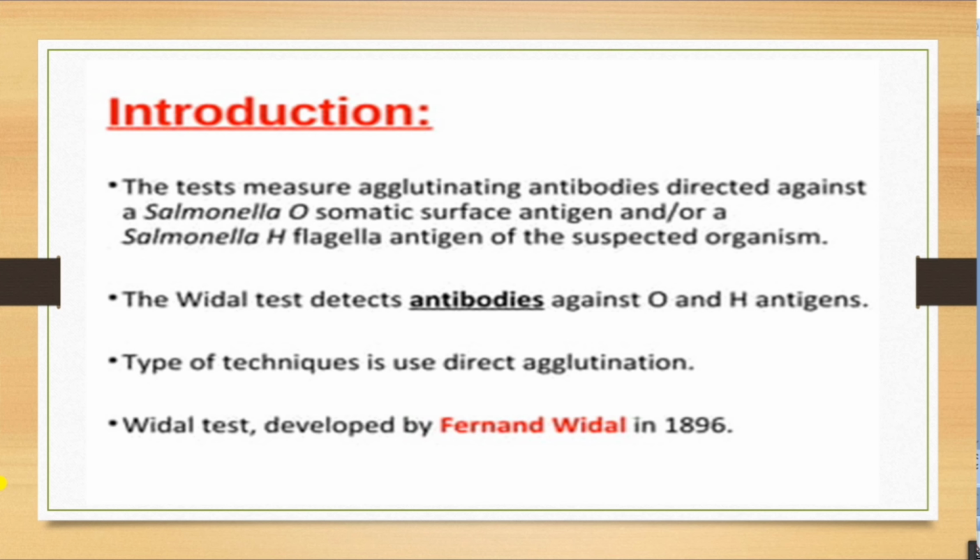The Widal test detects antibodies against O and H antigens. The technique used here is direct agglutination, which was developed by Fernand Widal in 1896.